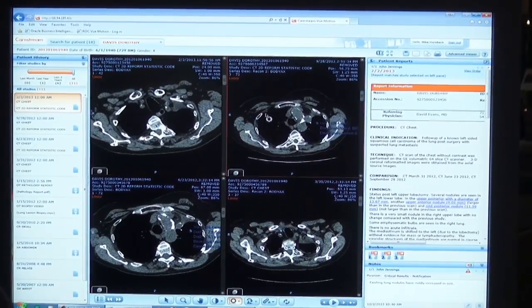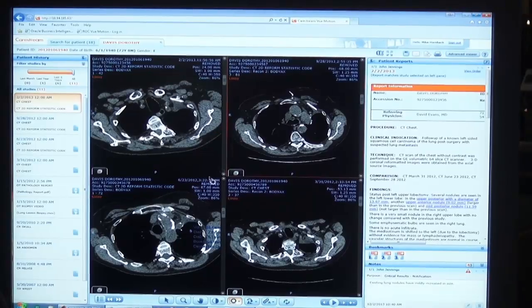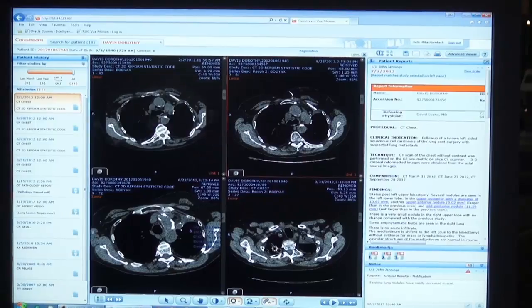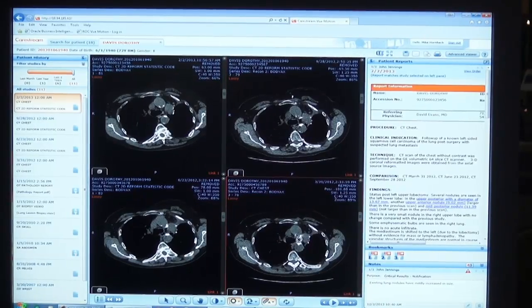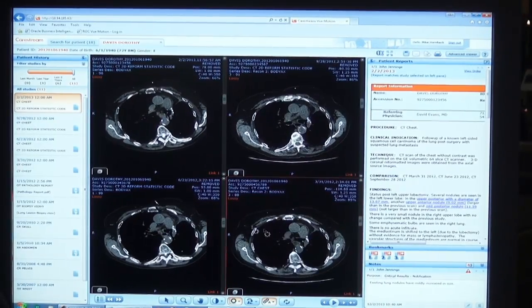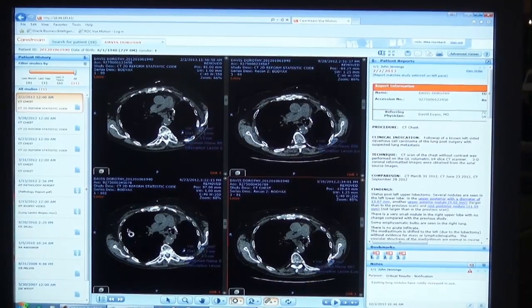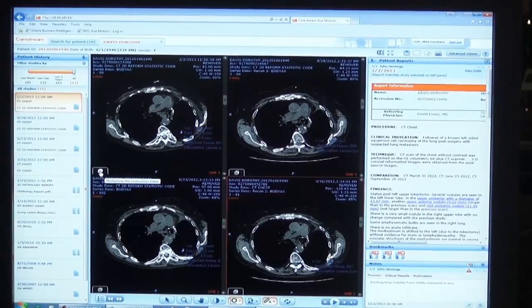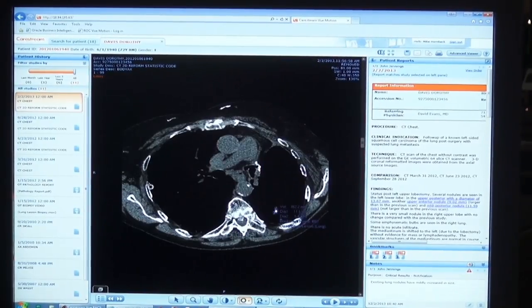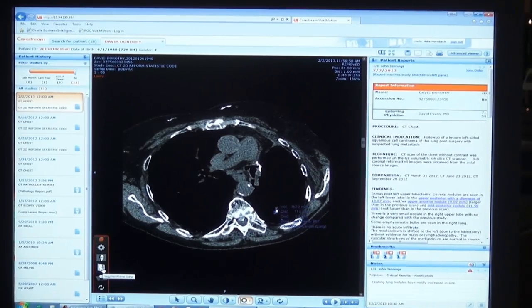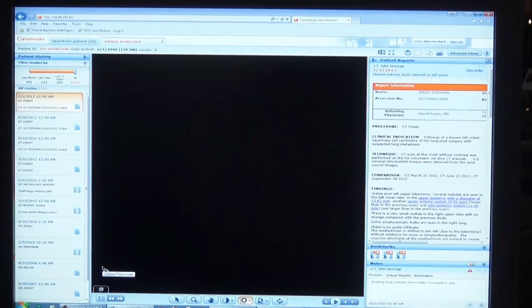We can also, even if we are on different slices in all four of these studies, automatically synchronize all four studies. We've also added some basic 3D functionality in the zero-footprint client. Here you see my wire box on the bottom — double click will bring me to a full-sized image, and this allows me to put the study into a sagittal plane or a coronal plane.